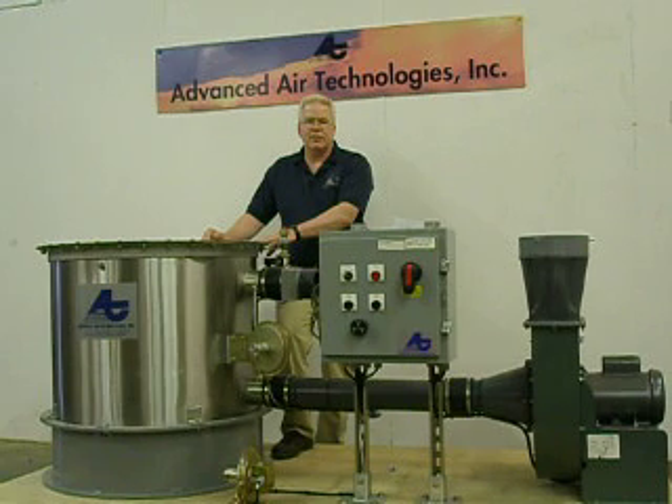The system operates at 208 to 240 volt, single phase, 50 to 60 hertz. It is CE compliant, and also UL and CSA compliant. For additional information, visit us on the World Wide Web at advairtech.com or call us at 989-743-5544.